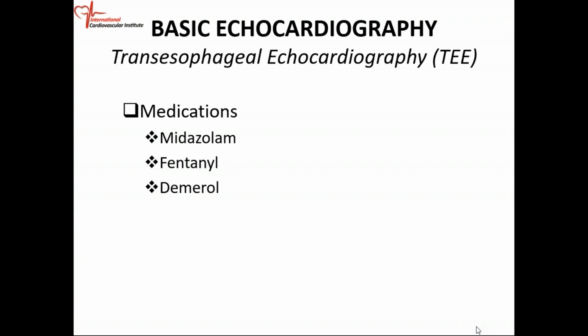Especially in patients with mitral valve prolapse, we usually evaluate these patients, and if they're going to have a procedure, the mitral clip or mitral valve repair for whatever reason, the surgeon likes to know which scallop is involved. So we'll look a little bit into the different scallops.